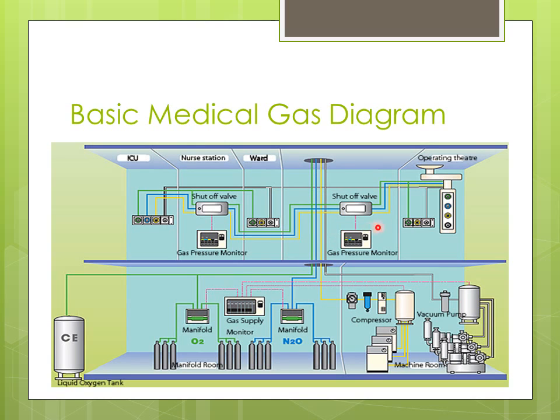Interesting too, if you look here, these are kind of examples of, well, here's an operating room, and also here's a gas pressure monitor. One thing I want to bring note to is that if you look at this line right here, this is like the room wall, this gray line going up and down. And you'll notice that your gas monitor is outside the room, okay, and your shutoff valves, as well as things you will run into later as we talk about medical gases, about location of shutoff valves and monitors.